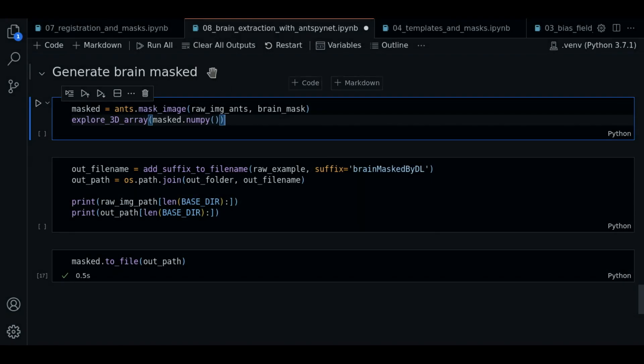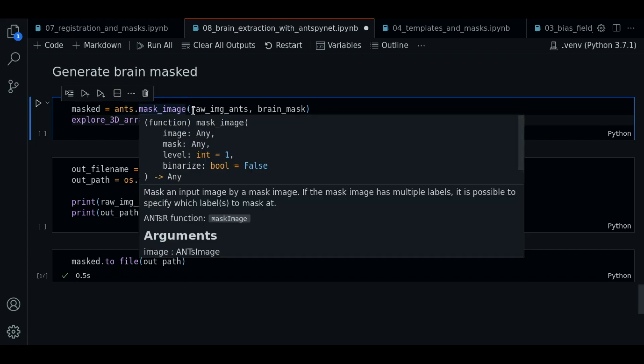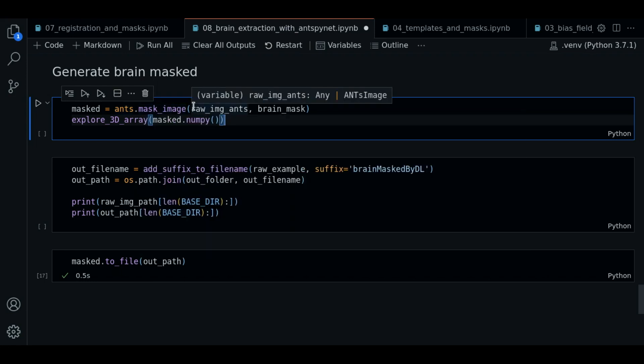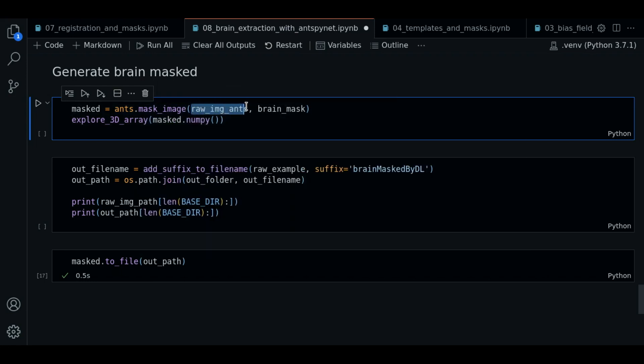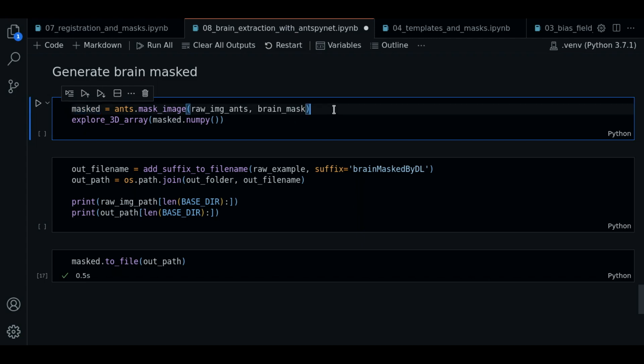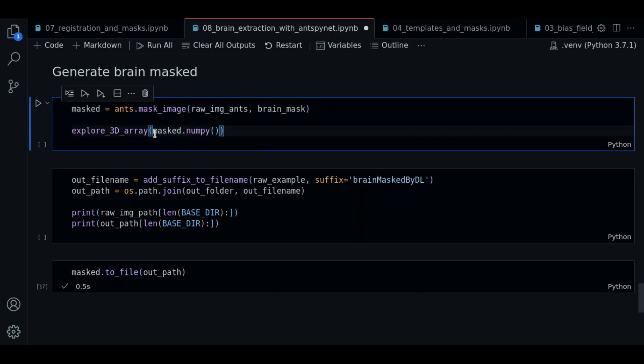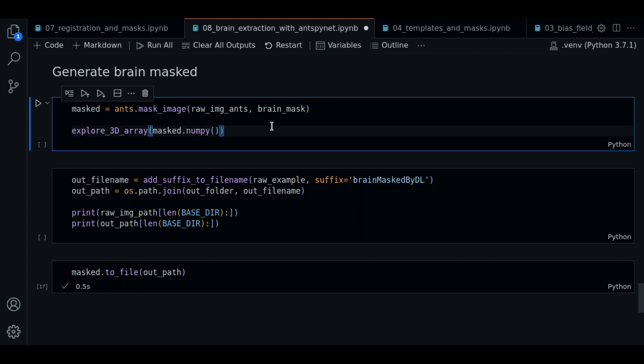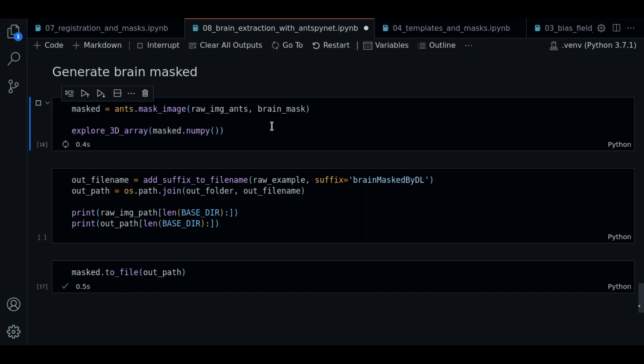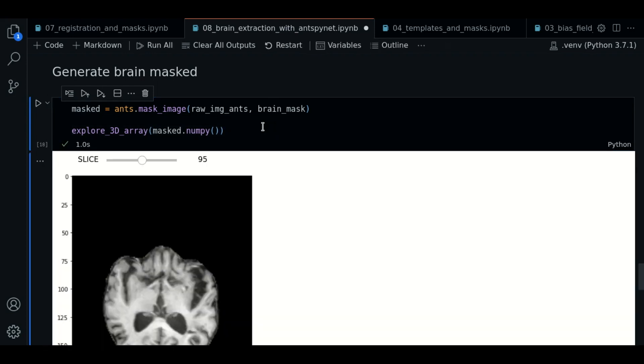And now what we're going to do is use this mask that was generated in the previous step. We're going to mask the brain now. So we use a function mask image. We pass the raw image and the brain mask generated. We're going to save this in this variable, masked. We're going to execute. And here is the result.